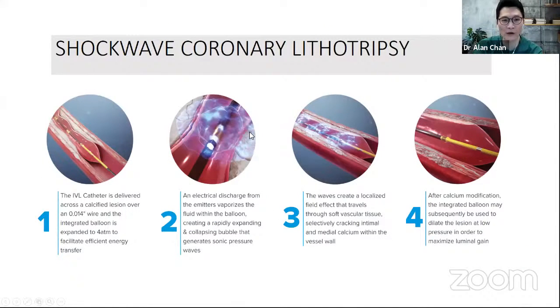So the rest of the talk will rest on the shock wave. I think it depends on your local availability. Shock wave uses the sonic pressure generated from the emitters through a balloon in order to achieve the calcium fracturing.